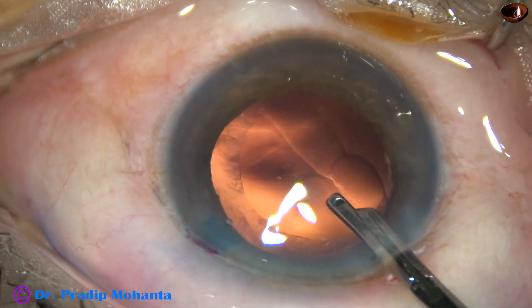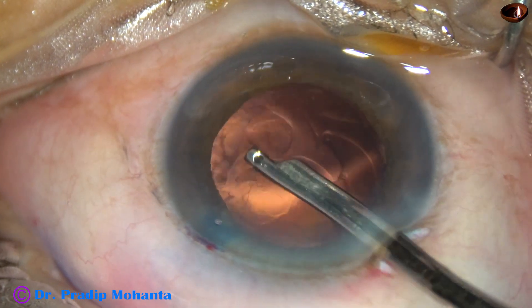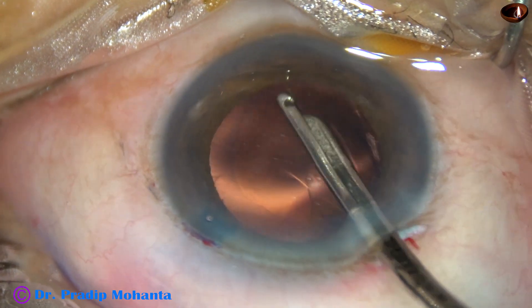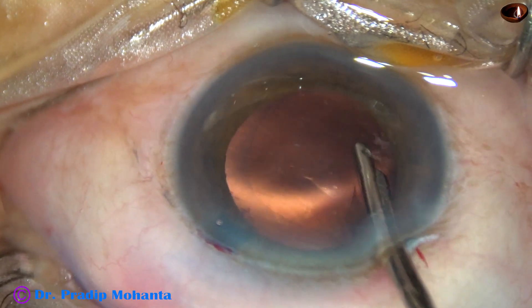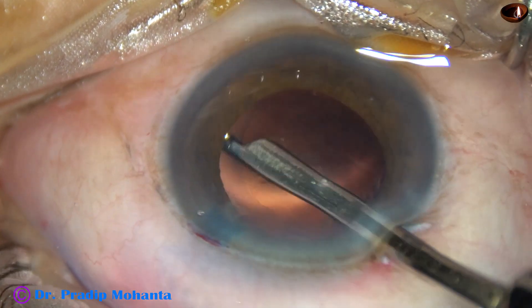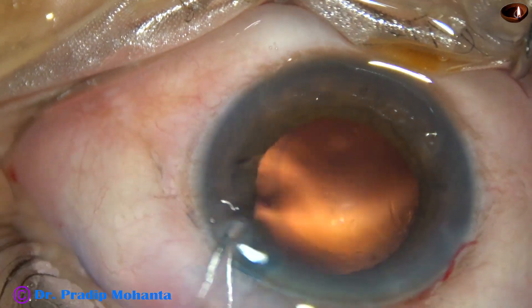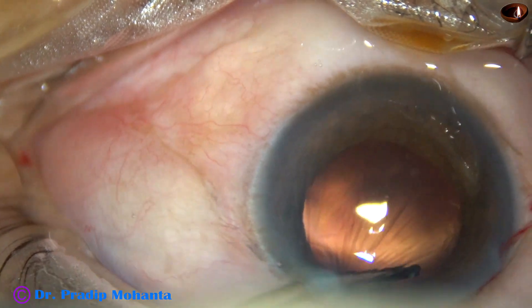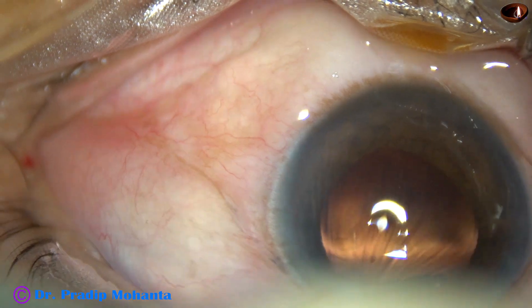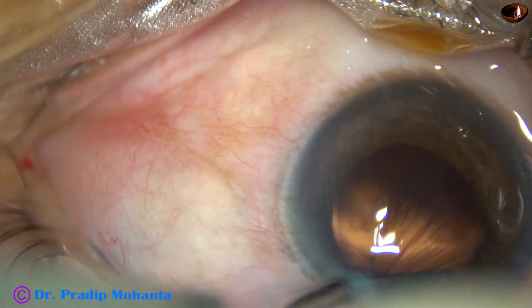This is aspiration of cortical lens matter with the help of a Simcoe cannula. When there is only one side port, cortical cleanup can also be done with coaxial irrigation-aspiration or by hybrid technique. In this case, the sub-incisional cortex was removed after several attempts.